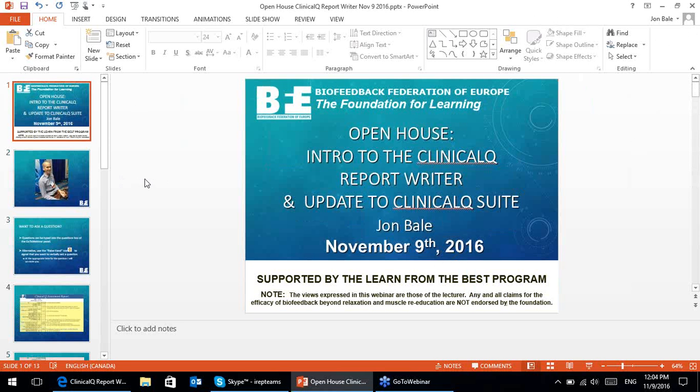Just so you all know, today is meant to be really just an informal session, nice and relaxed, and so I'm going to be showing you guys this new report writer that we have running, as well as some updates to the ClinicalQ software suite. And as we go along, I'm really happy for any of you to ask some questions and send in comments. It's not meant to be formal. This is just much more of a relaxed and easygoing session.